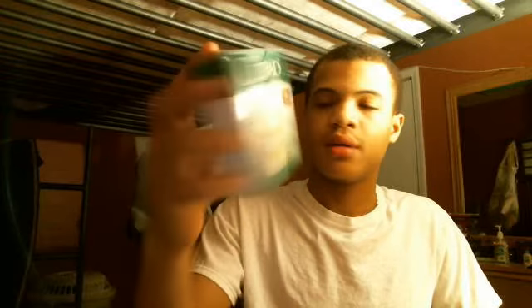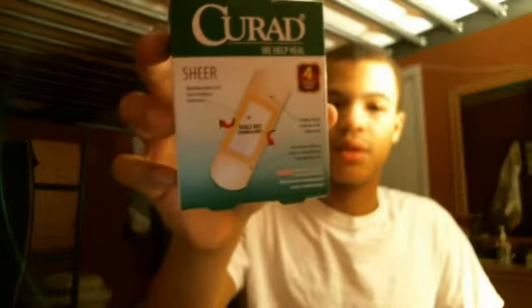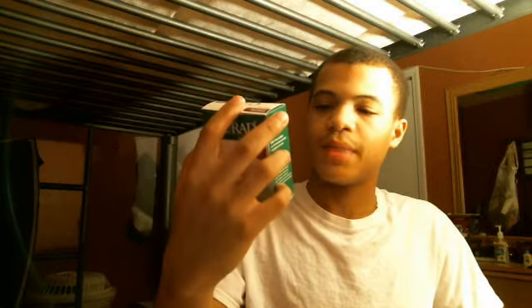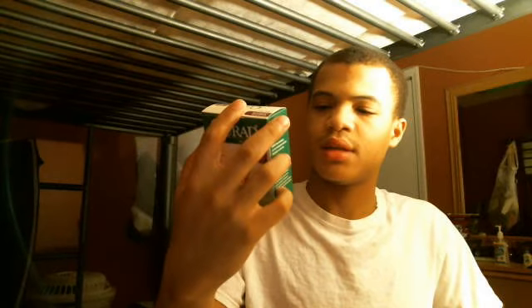Currad band-aids — they help heal. The nonstick pad does not stick to your wound. This is flexible plastic that stretches with movement and seals out dirt. On the other side, it's less noticeable on your skin. And this pack has about sixty bandages.